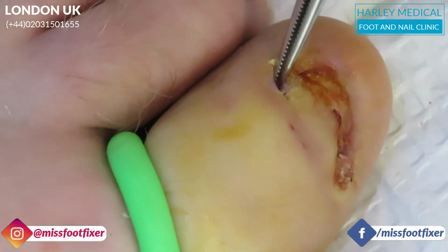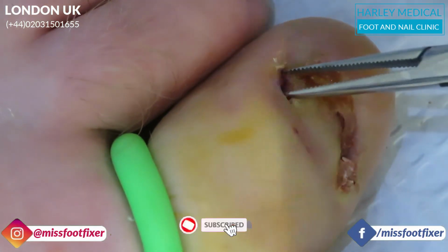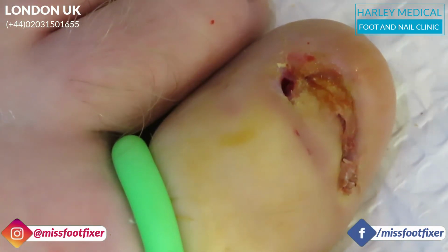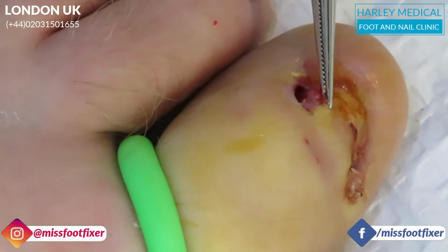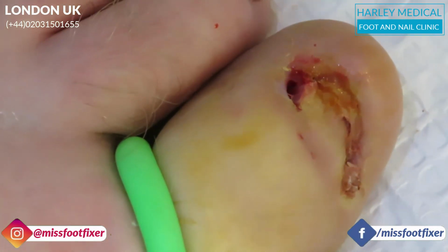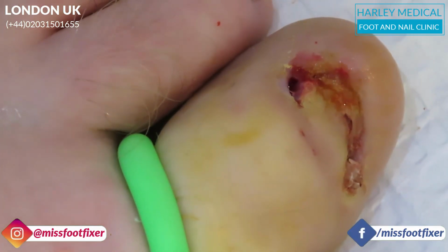Have some gauze, please. Sure. You're not sending off the nails, right? No, no. What I'm going to do is, I'm also going to take off some of this dead tissue here. Is that okay? Oh, good. All of this stuff, yeah? Yeah. Well, it's just there's lots of scar tissue around here, so we'll remove it.